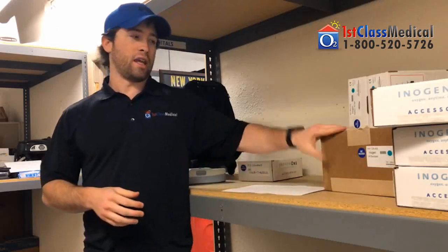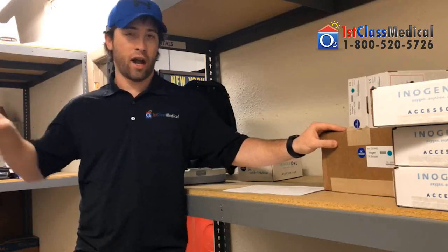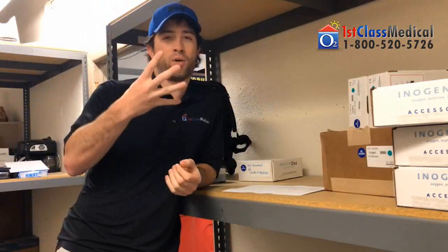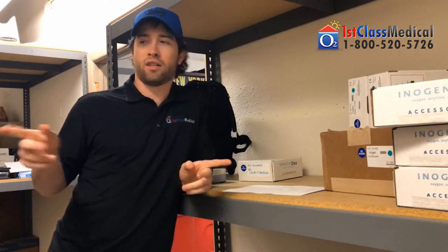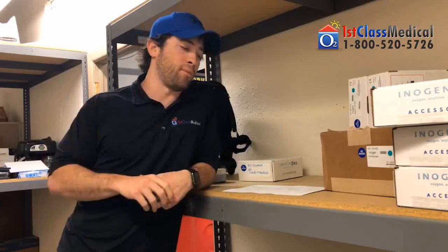Pulse flows are measured as settings. Now it gets a little confusing, but to sum it up real quick, a 2 pulse on an Inogen unit and a 2 pulse on, let's say, a Life Choice Activox unit are actually not the same amount of oxygen. Each concentrator has a different bolus size, that's the size of oxygen that it gives out per pulse. So they're known as settings, and just because a setting of 2 on this and a setting of 2 on this have the same setting of 2 doesn't mean that it actually is giving you the same amount of oxygen. So just a heads up there when shopping.